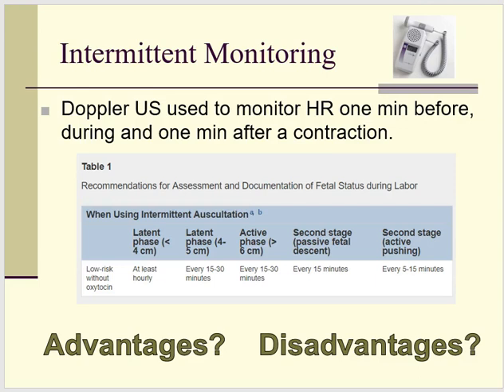So in the meantime, we've been talking about how else we can use the best of fetal heart rate monitoring while avoiding some of the disadvantages. Continuous fetal heart rate monitoring does keep mom fairly limited in her mobility. If we use internal monitoring, we have the additional risk that we talked about as well, not to mention the expense.